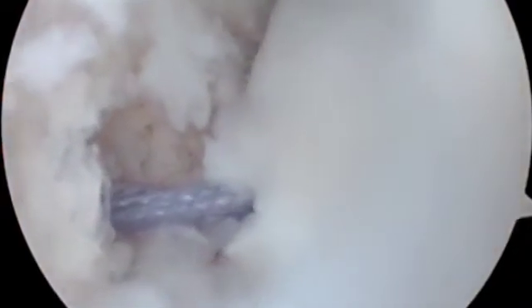Once the anchors are placed, the anterior inferior capsulolabral repair is completed by tying the sutures. For the remplissage, a double pulley technique is employed.